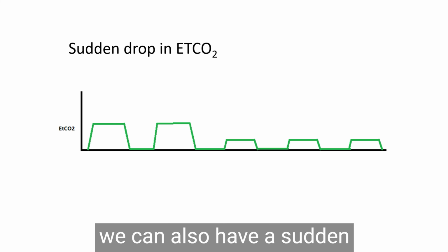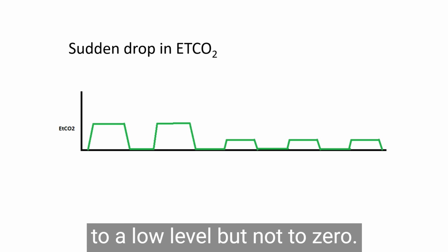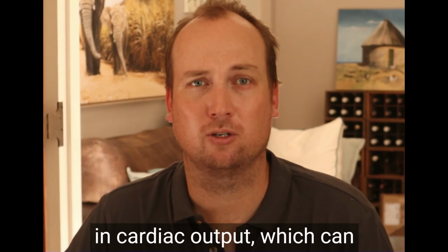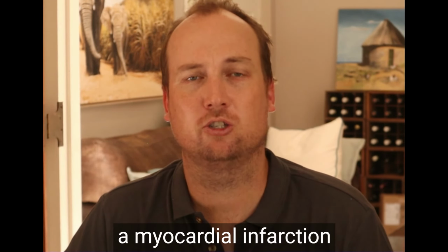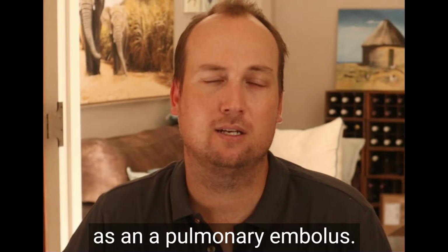We can also have a sudden drop of carbon dioxide level to a low level, but not to 0. And we see this in situations where there is a sudden drop in cardiac output, which can be cardiogenic, for example, a myocardial infarction or cardiac arrhythmia. It can also be obstructive, such as in a pulmonary embolus.